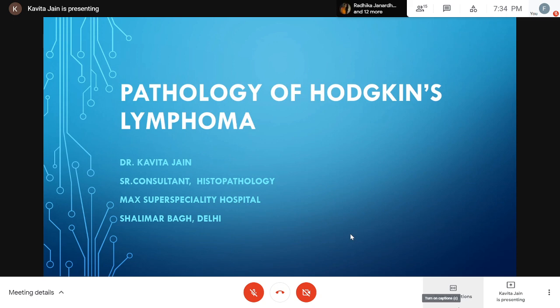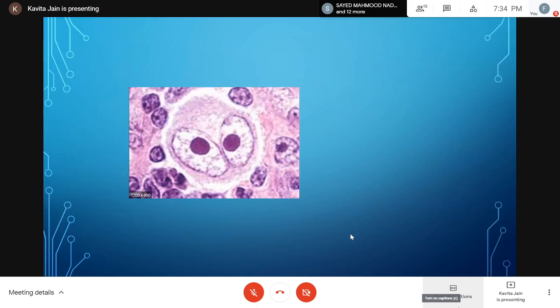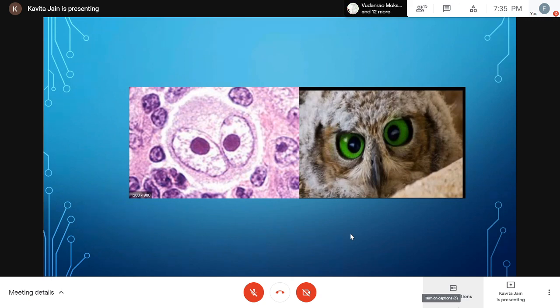Hodgkin's lymphoma commonly comes to the attention of morphologists with an unmistakable image of this gigantic atypical cell, which is seen looming over the sheets of small mixed inflammatory cells. This cell is the Hodgkin-Reed-Sternberg cell, which has a peculiar resemblance to the owl's eye. And the scary look of this owl, throughout our entire career, we won't be able to forget the RS cells.